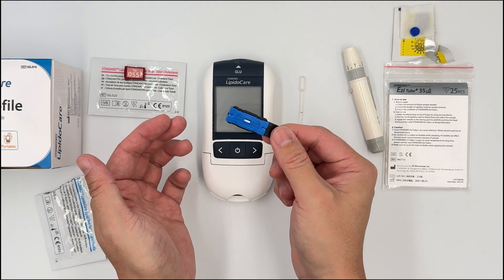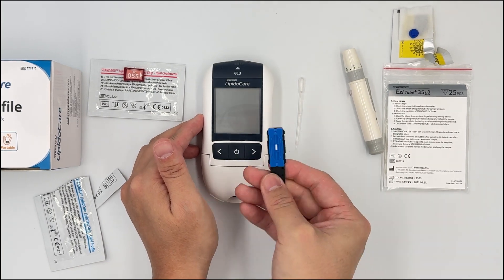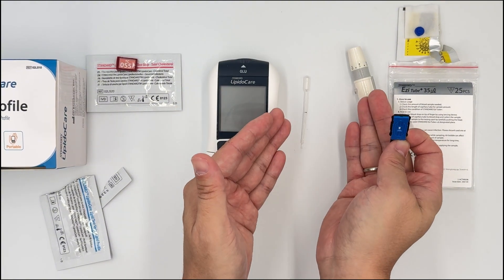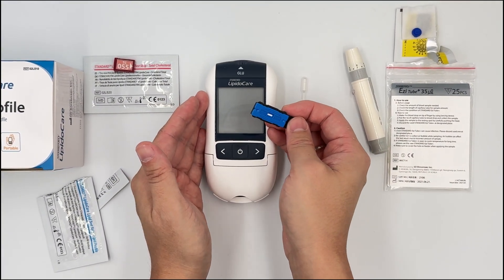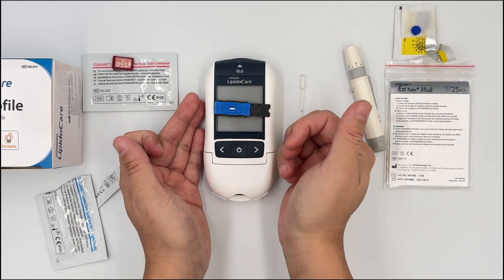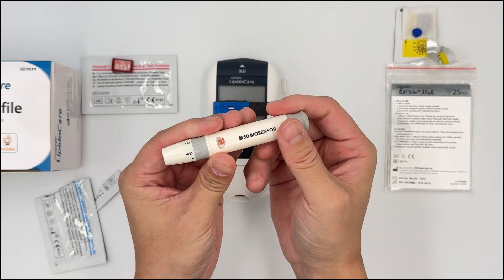If you're a beginner, a useful tip: place the test strip on the meter, not inside the meter. If you put it inside the meter, it will switch on immediately, and if you take too long to take the blood, the meter could switch off. You might not notice and get an error sign. So put the strip on the machine, then proceed to prick the patient.